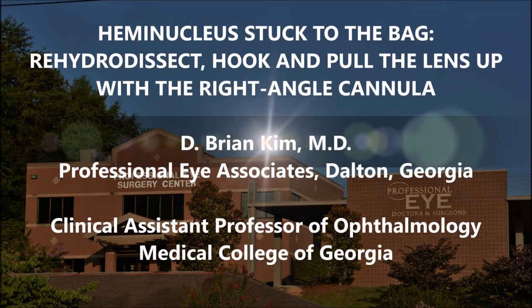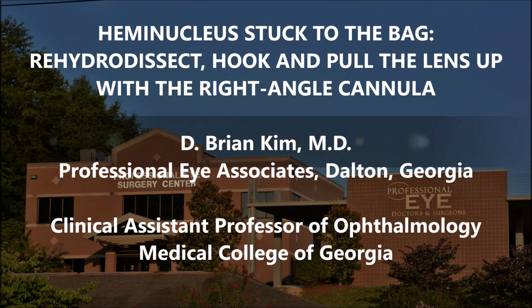Hi, this is Brian Kim. I'm going to share with you this case of a patient with a moderately dense lens. Even though I was able to spin the lens during hydrodissection, when I tried to spin the second heminucleus in front of me, I noticed there was quite a bit of tension. The lens was kind of stuck to the back still, and there are some weak zonules with this dense lens. You're going to see how I'm able to very easily help prolapse that second heminucleus up out of the back.